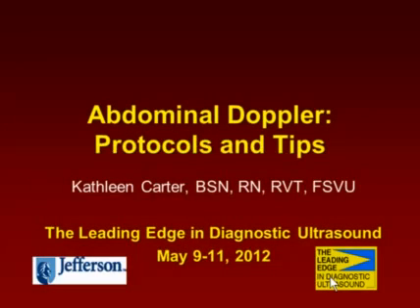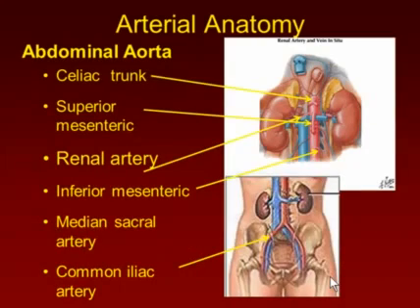I'm going to talk about the abdominal Doppler, protocols and tips, specifically about the abdominal aorta and the mesenteric system. A little review of anatomy.